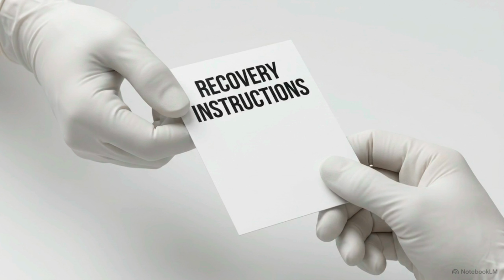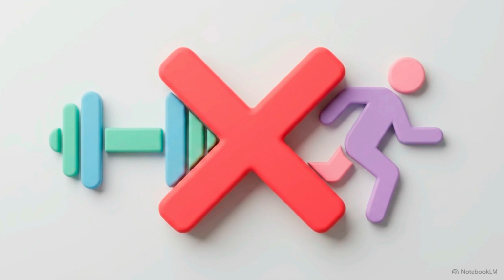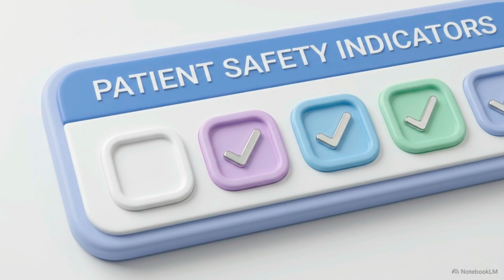The final step is post-donation care. Before the donor leaves, provide their post-care rules. They need to rest, drink extra fluids for the next 4 hours, and avoid strenuous activities for the remainder of the day. You must also monitor for adverse reactions.